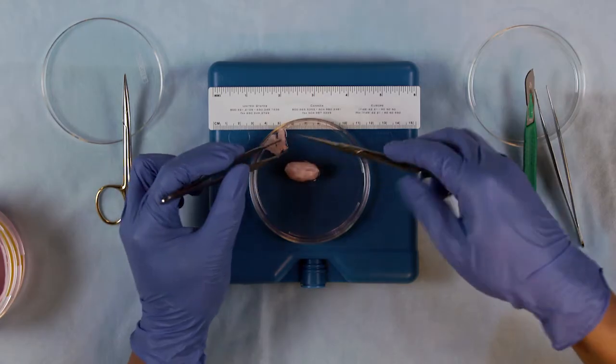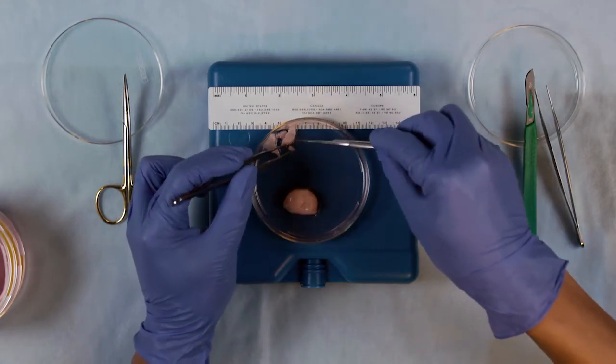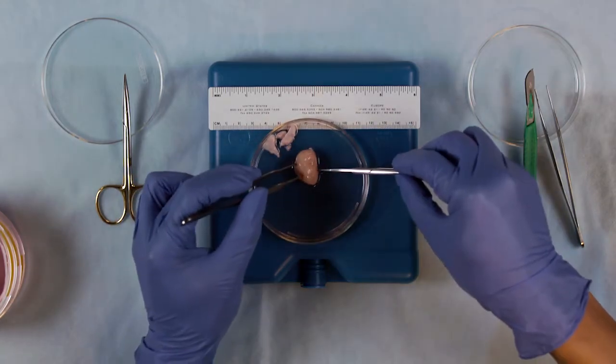After cutting off any ligaments from the tissue, bivalve the ovary or cut it in half on the longitudinal axis.